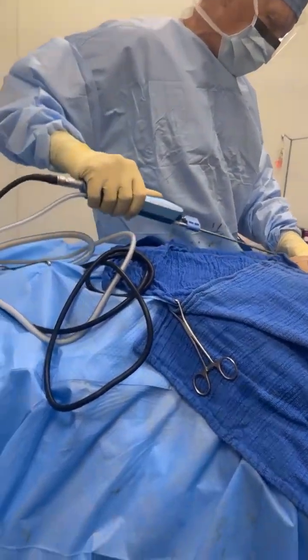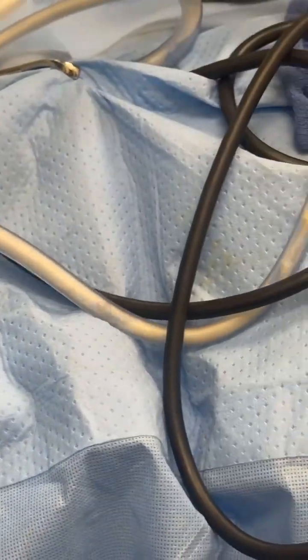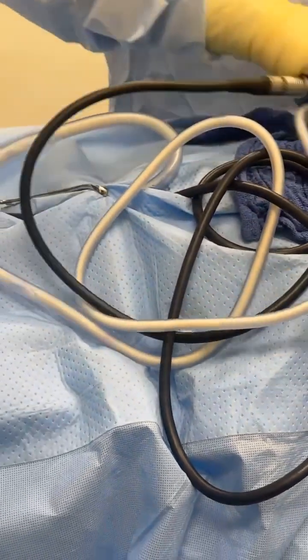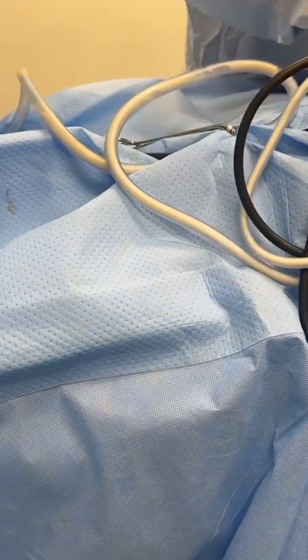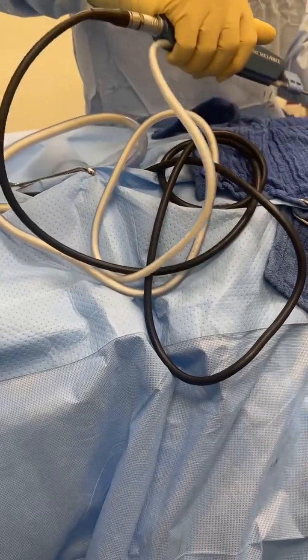What do you think about this output that you see? I mean, it's the perfect output that you want to see. You want to see that bright golden color without any pink in it. It needs to be pure, clean fat. So this is exactly what you want to see when you're looking for a liposuction fat transfer BBL.